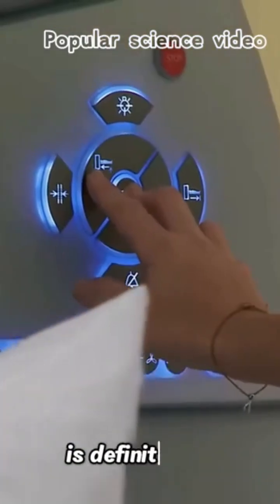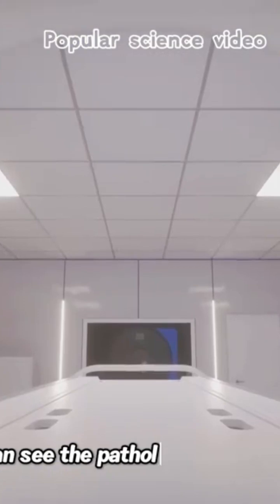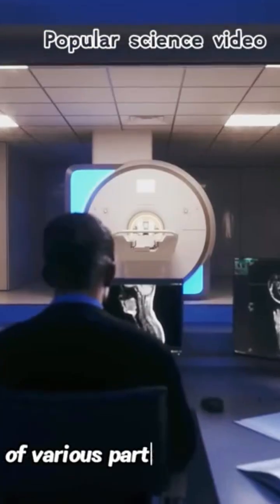Magnetic resonance imaging is definitely the greatest invention in medical history. It can see the pathological conditions of various parts of our body. What is the principle behind this?